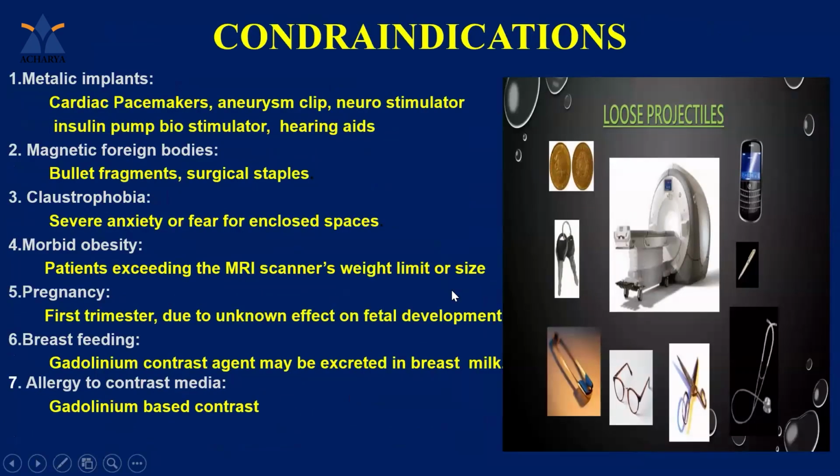Contraindications are most important for technologists. Patients with any metallic implant, we should not enter into zone 4, that is the gantry.